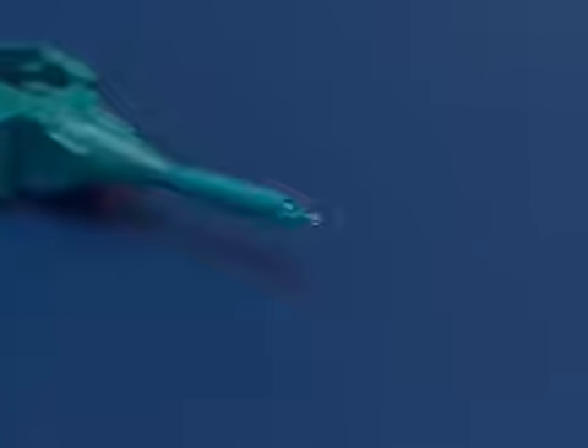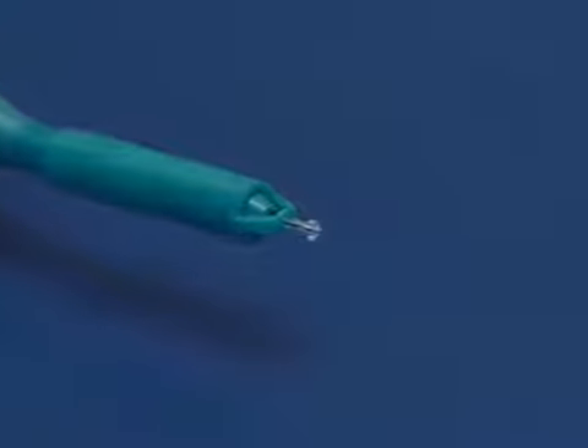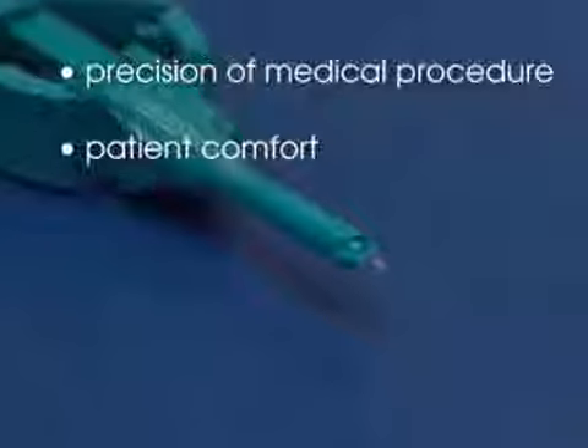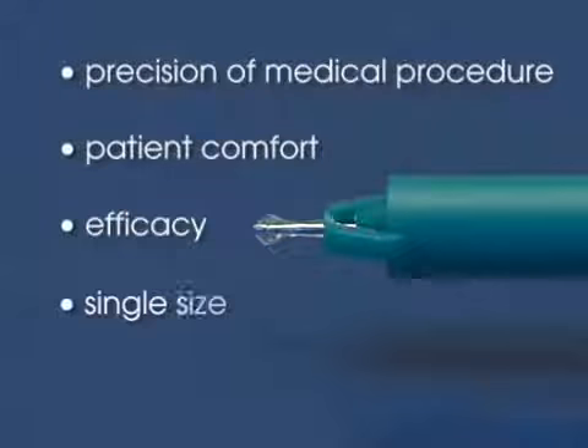This FCI innovation improves patient comfort and simplifies the procedure for the practitioner. The procedure is more precise, quicker, and painless for the patient. The painless plug ensures optimal punctum occlusion. There is only one size of painless plug, which simplifies its use considerably, and a single part number is required for stock keeping purposes.